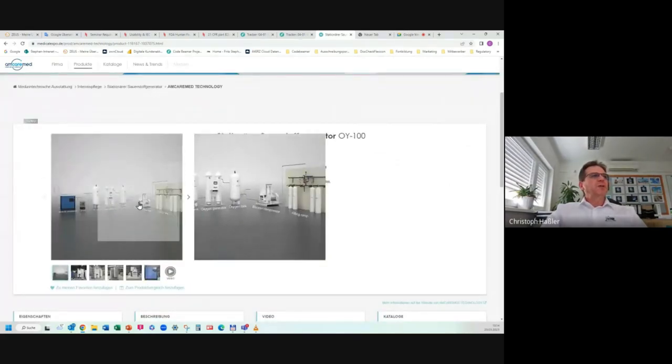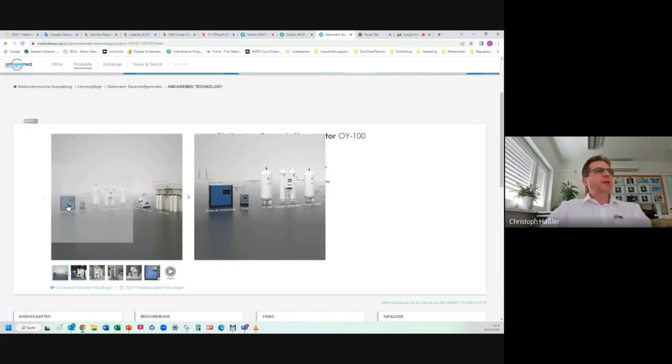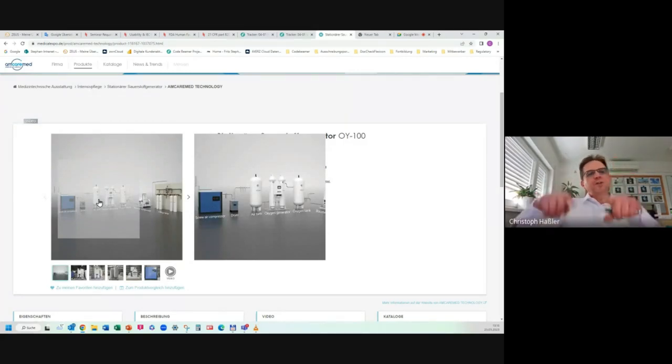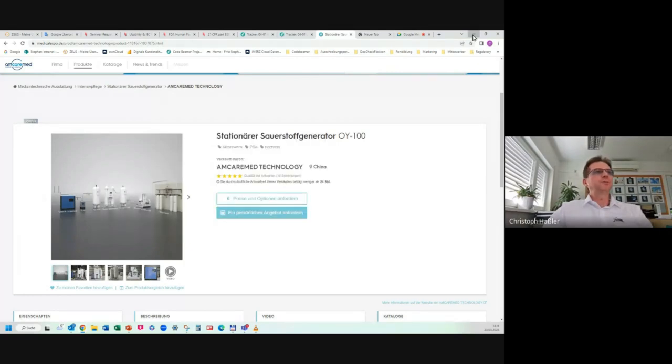So this is a normal oxygen concentrator plant for hospitals and things like that. In huge or bigger installations, you have a high pressure booster, you have a compressor, mostly oil driven. You have a dryer because you work with higher pressures, 7, 8, 9 bars. Then you have an air buffer tank in the middle, which is the white one here, the first one. Then you have these two tubes, which are the oxygen generator modules, and they are quite huge tanks. Then the oxygen is generated there, and you have a second tank for buffering. And then you can have a high pressure booster to fill the generated oxygen into cylinders, for example.